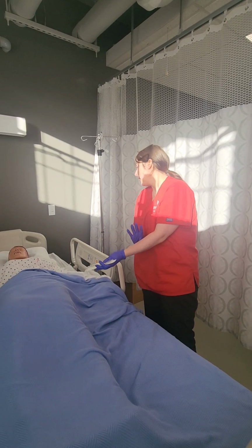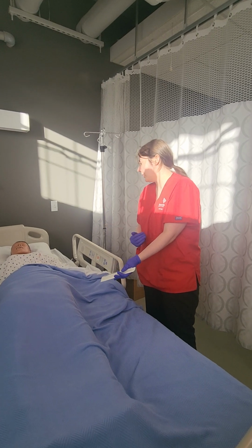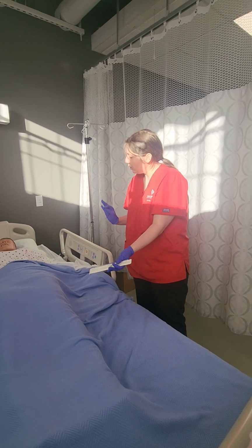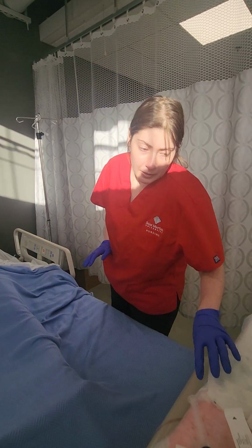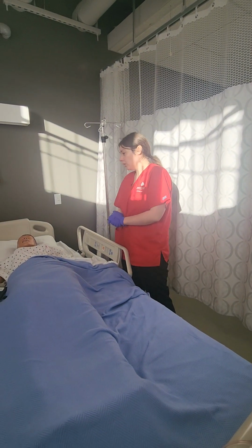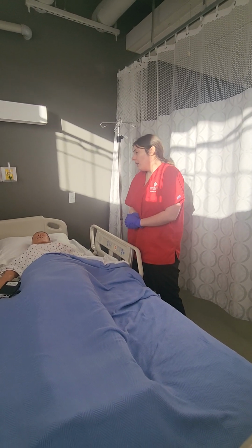And what's going to stay is that little catheter that I'm going to hook up to some tubing, and that's what we're going to inject the fluids into. And the procedure shouldn't hurt after that. It will be a pinch and a burn right at the beginning, but after that it shouldn't hurt at all. Just to double check, do you have any allergies to iodine or latex?